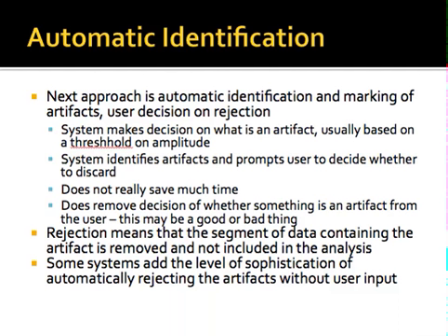Rejection means literally the segment of data that contains the artifact is physically removed and not analyzed. So in addition to systems automatically identifying, there are some systems that will also automatically reject without any user input. So literally this means the signal is actually physically removed.